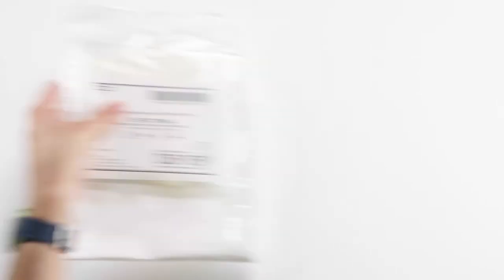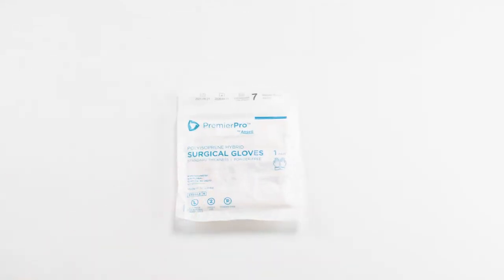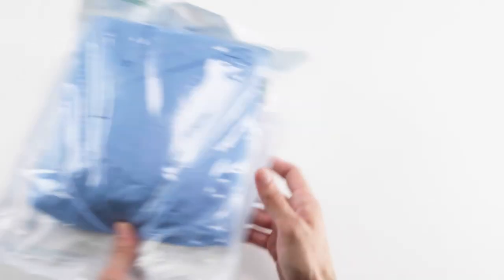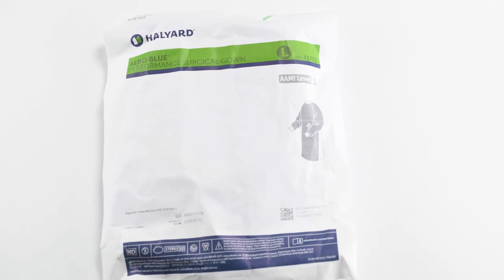In preparation for the insertion, we want to gather our materials and set up our sterile field, beginning with the adhesive tape that will be placed on the table. On our sterile field, we're going to place the following sterile equipment, beginning with size 7 gloves — I'd recommend wearing something that's comfortable for you. Alongside your gloves, you're going to use a sterile gown, also to be opened and placed on the sterile field. Next we'll use chloroprep, which we'll use to sterilize the skin.